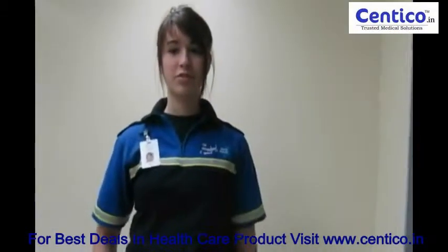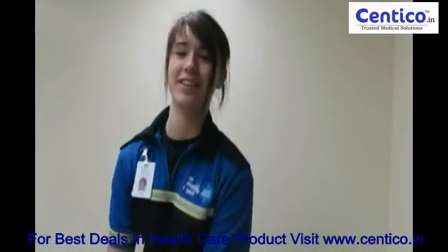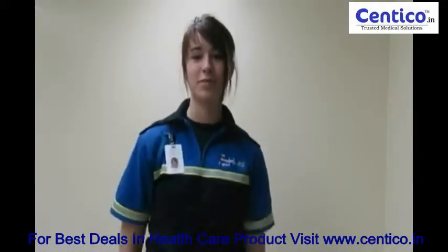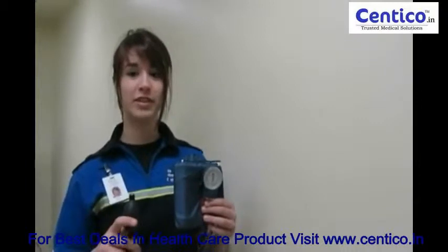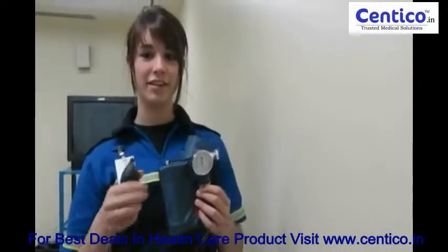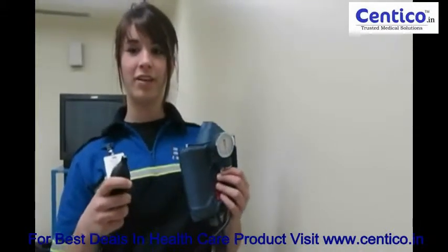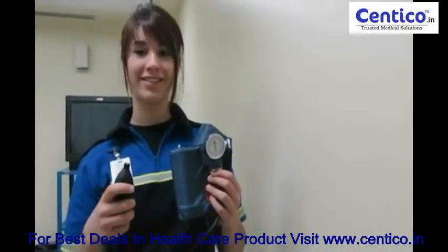The instrument used to measure blood pressure is a sphygmomanometer. This is an important tool in pre-hospital emergency care and also in several areas of health. There's a pump that compresses air to tighten the cuff around the arm. During this compression, there is a dial that allows us to see the pressure imposed on the brachial artery.